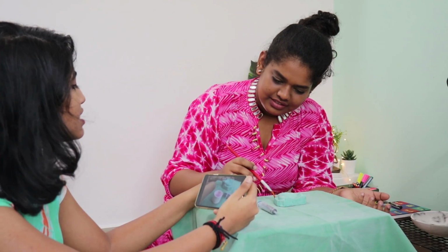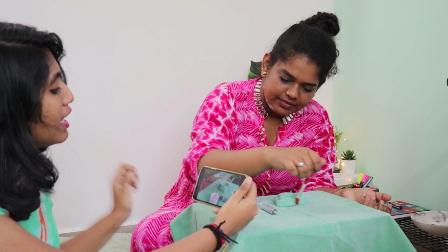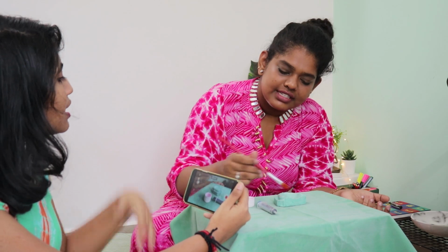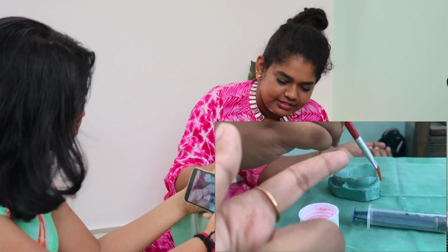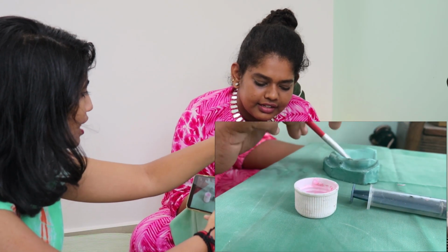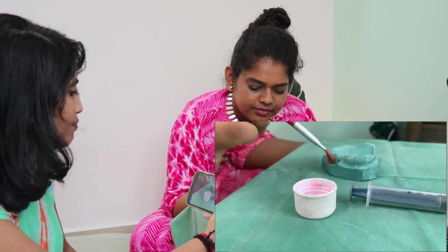See, this is a normal cast. It's a model cast. Bomma cast, okay va? Yeah. Patient vaayil eduthu pandrathu vandu dhaara maadhiri irukum. Okay, it's like for, you know, old people have. Yeah, correct. Andha idhu dhaan ipo inga replicate pannirukanga. Ona theriyadha inga pallu space edhuvume illa. Yeah. Okay. Pallu space irundha vera maari irukum paaka.